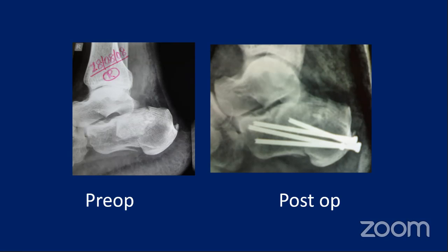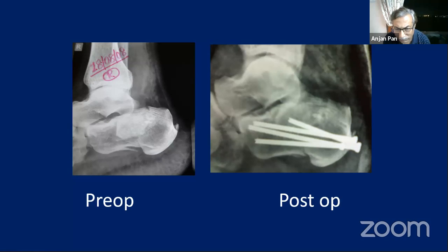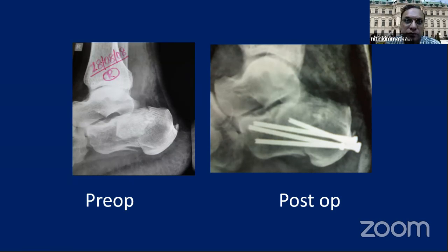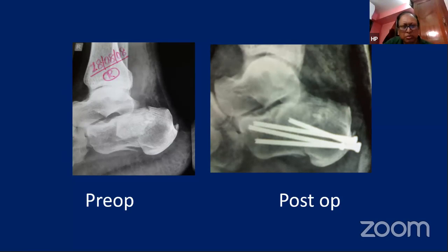Yeah, Ujjwal sir wants to put some views in it too. I just wanted to ask you, did you open the joint at all, or just from external maneuvers you have manipulated the fractures? From the external maneuver. But I am using this periosteum elevator from cutting both the sides with small nicks to lift up this subtalar joint. So you have the X-ray of the subtalar joint. Excellent, sir. Follow-up you have, sir.